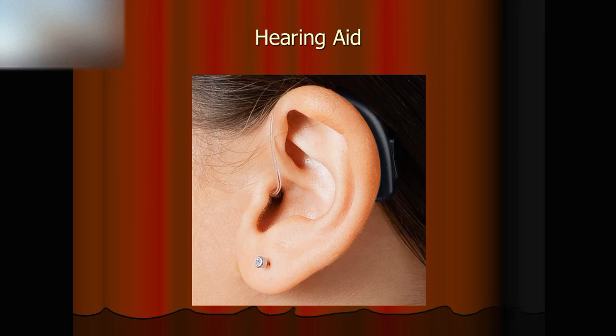A hearing aid is a mini device that we can use to amplify environmental sound so that we can hear them better and we can have better clarity.